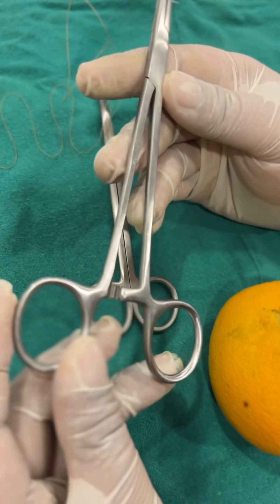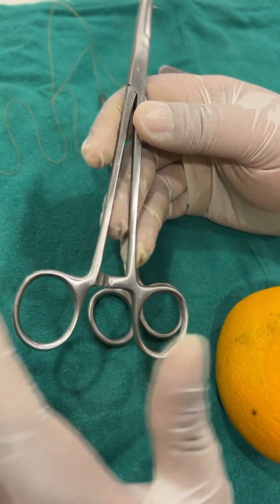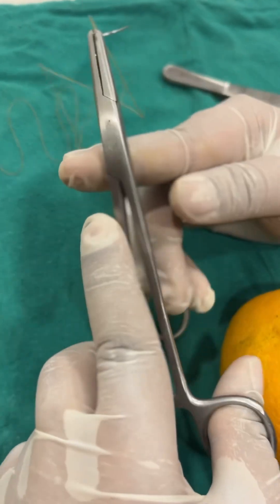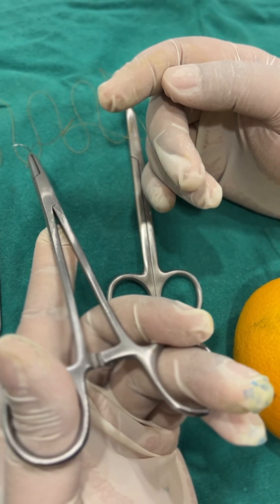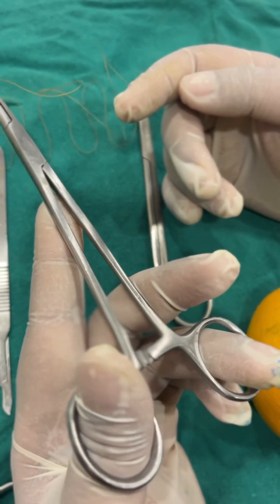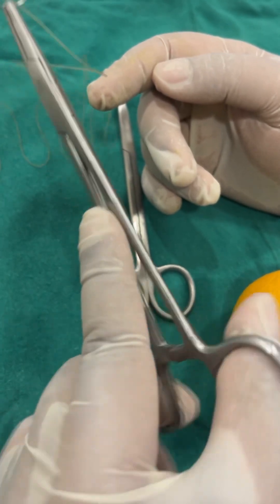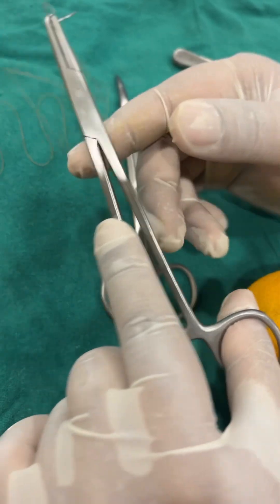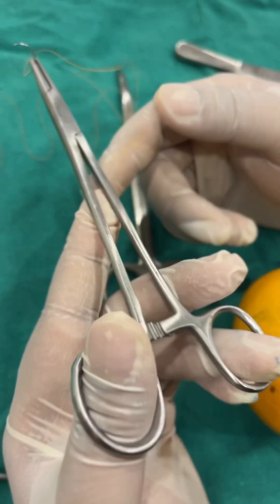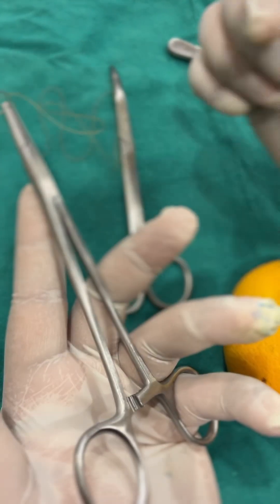Before we proceed to suturing, let us understand how to hold a needle driver. There are multiple grips, but the common grip is a tripod grip where you use your ring finger and thumb to hold the needle driver. A common mistake is that instead of engaging the ring finger, clinicians engage their middle finger — it's not completely wrong but gives less control. I personally use a modified thenar grip where I use my little finger with no engagement on the other side.